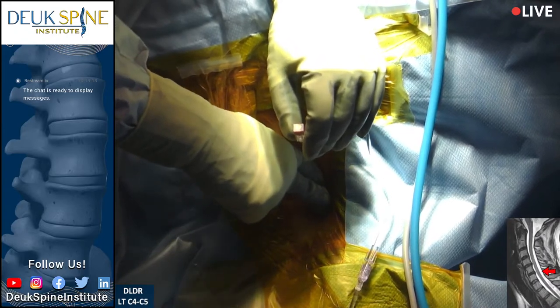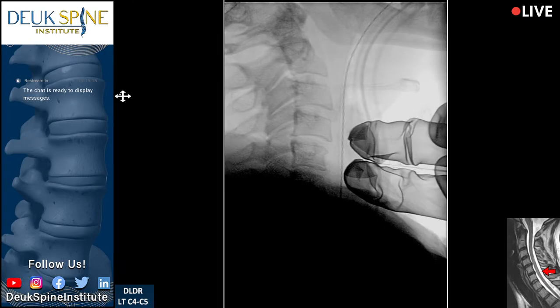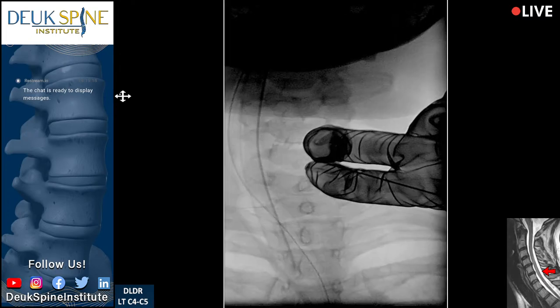She seems to be responding — looks like I'm at five-six; I need to be a little bit higher, we want to be at four-five. We need to be a little bit more north. I'm still feeling her spine moving — I need something to keep her from flexing. That's looking good. Let's get a shot AP — let's see where our needle is. That looks good, back to a lateral.